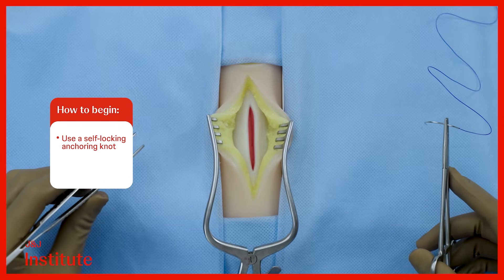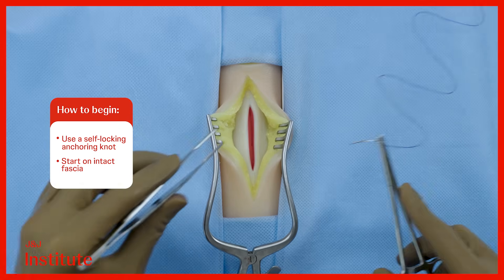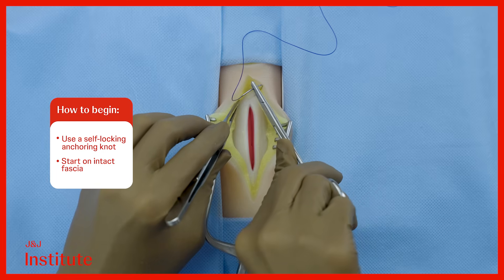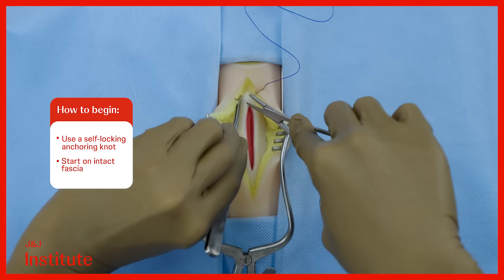We begin by creating a self-locking anchoring knot. The first bite is taken on bare fascia about 5 mm beyond the end of the incision.